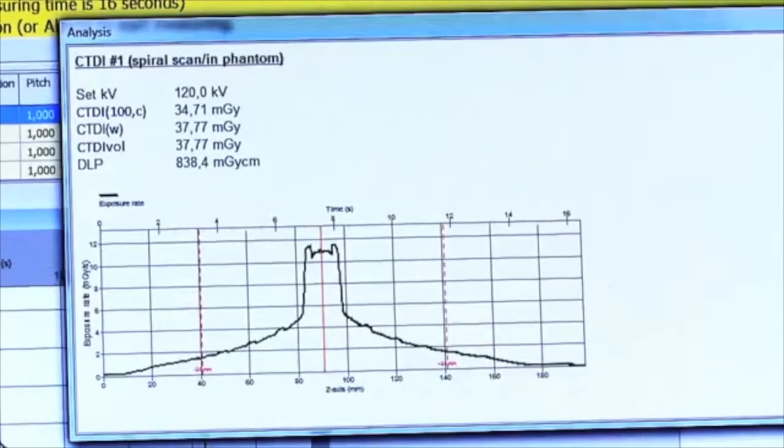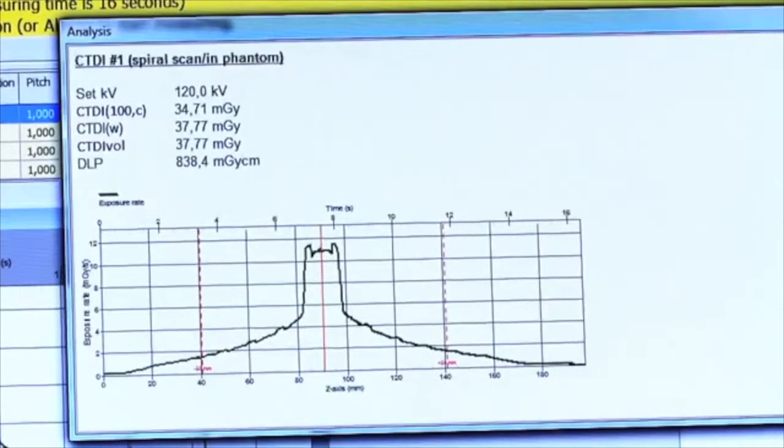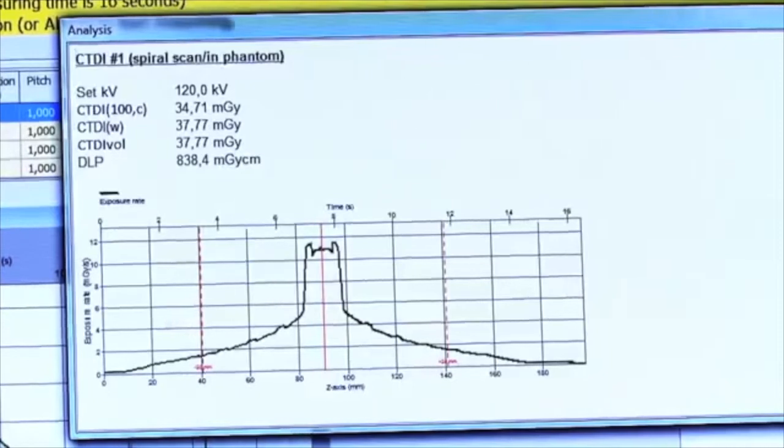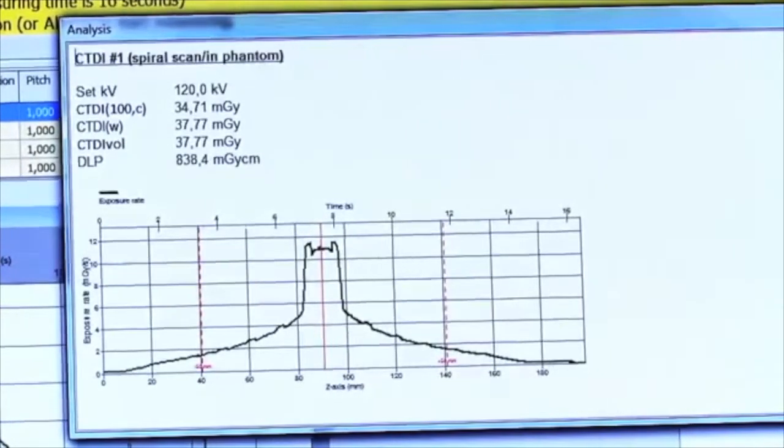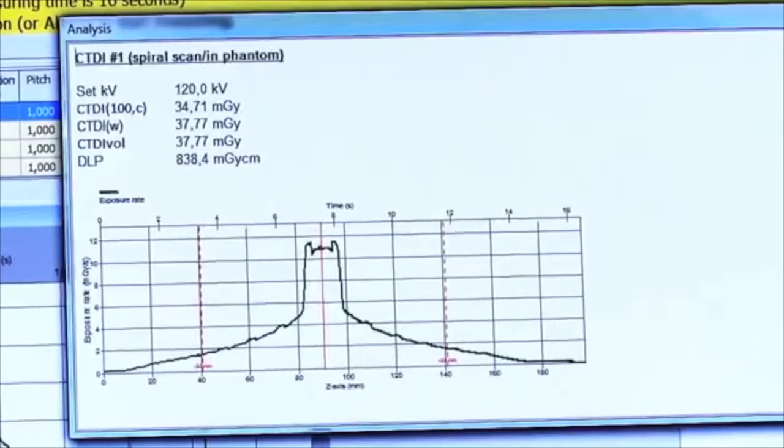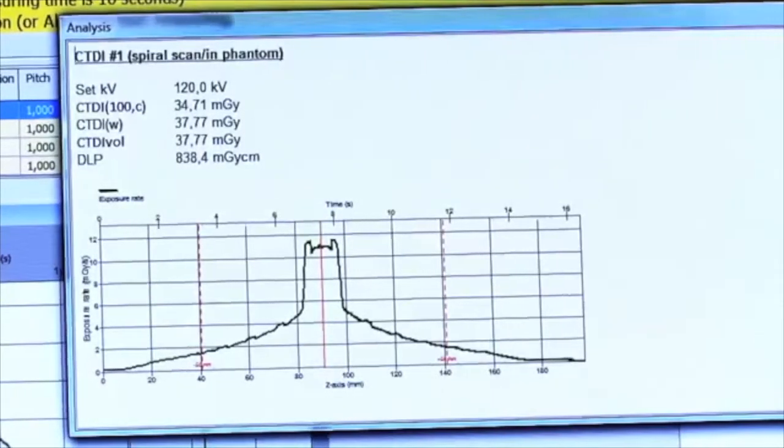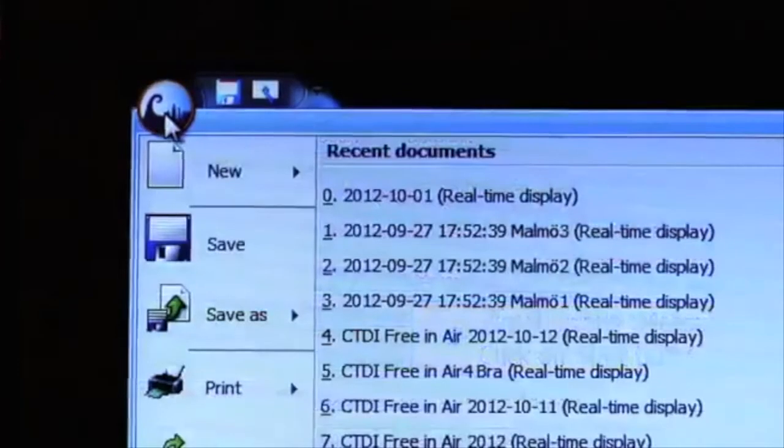You can see a clear view of the dose profile. The dose between the two red lines is the CT dose index 100. You can see the attenuation in the neck support at the top of the dose profile. Save the data.